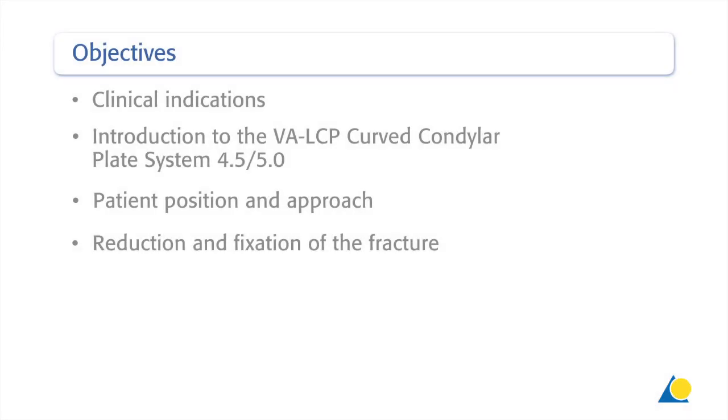The objectives are to identify the clinical indications, to introduce the principles of the variable angle LCP curved condylar plate system 4.5/5.0, to show the patient position and approach, and perform the reduction and fixation of the fracture.